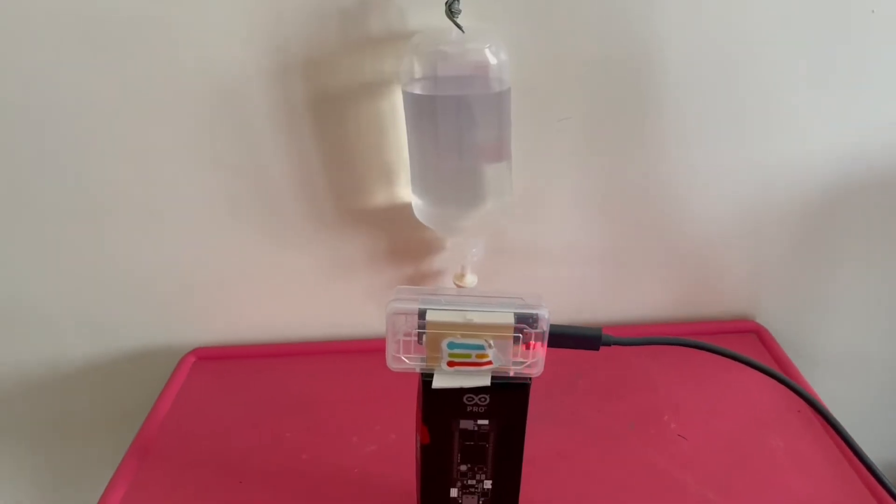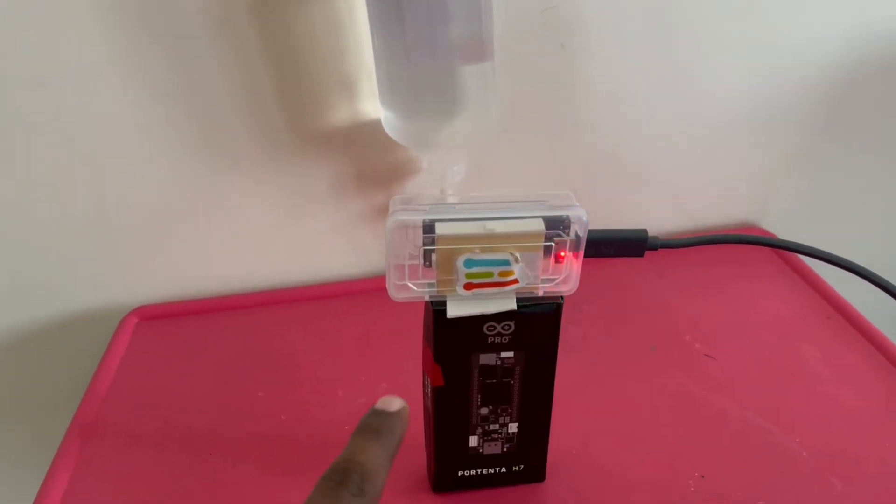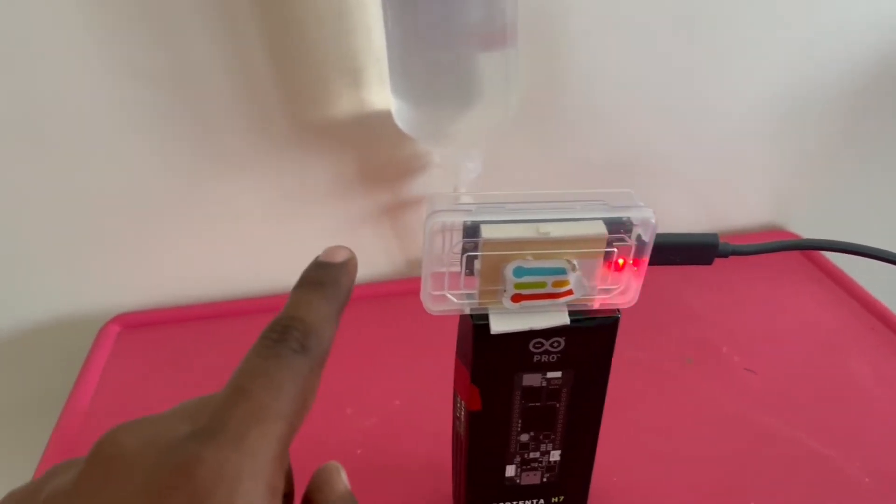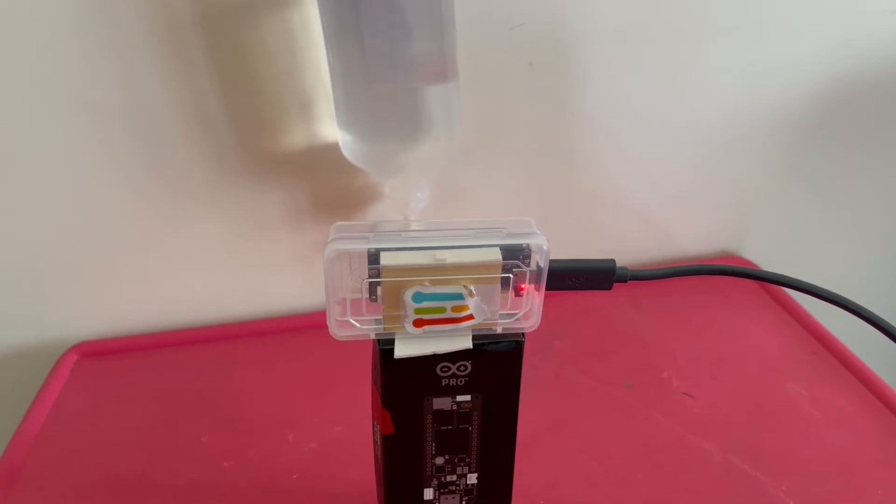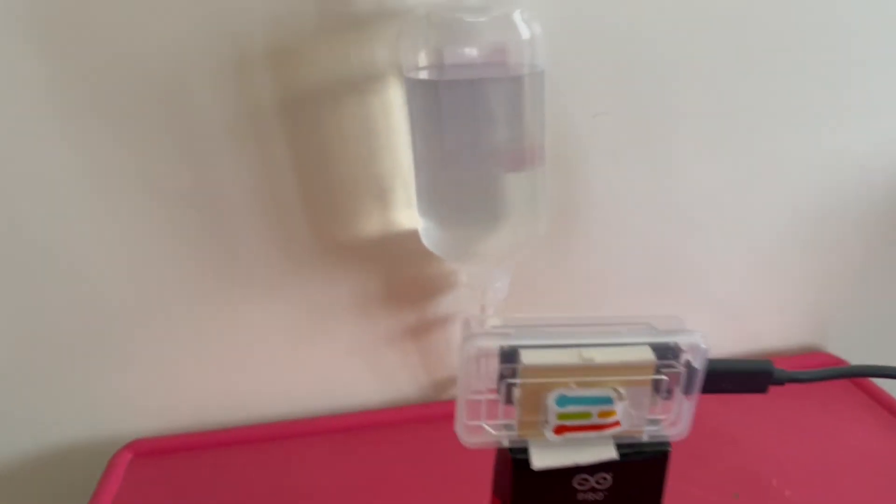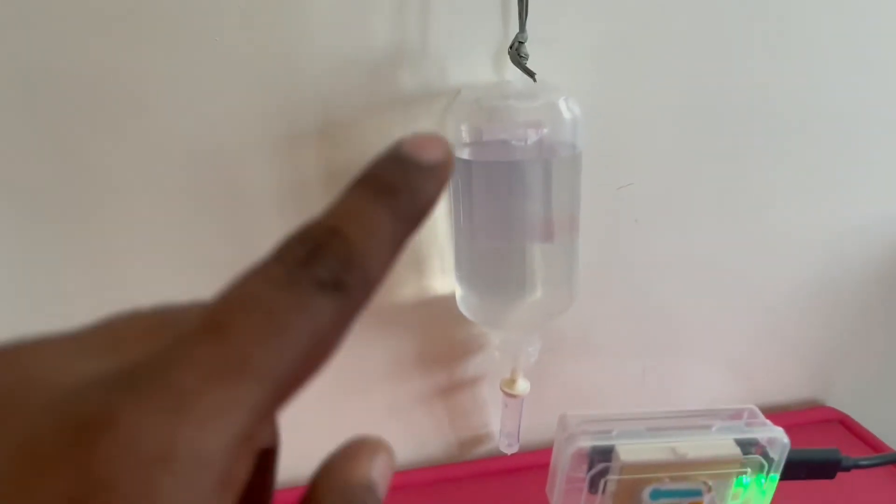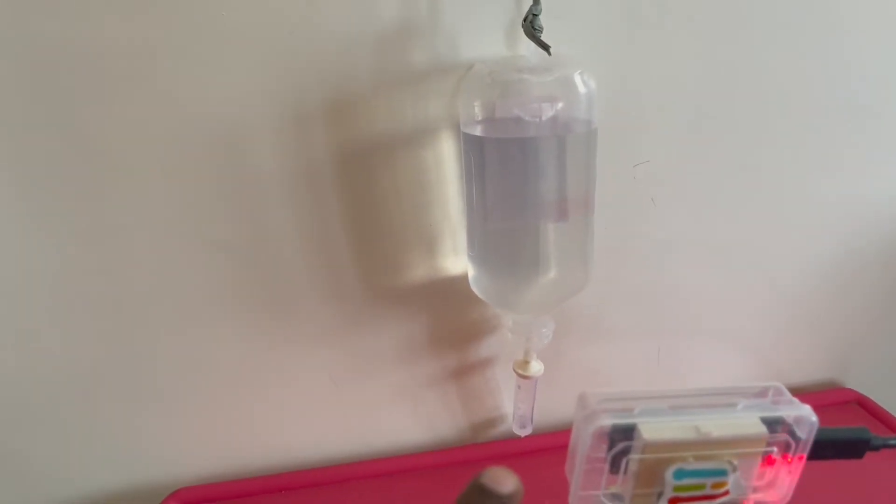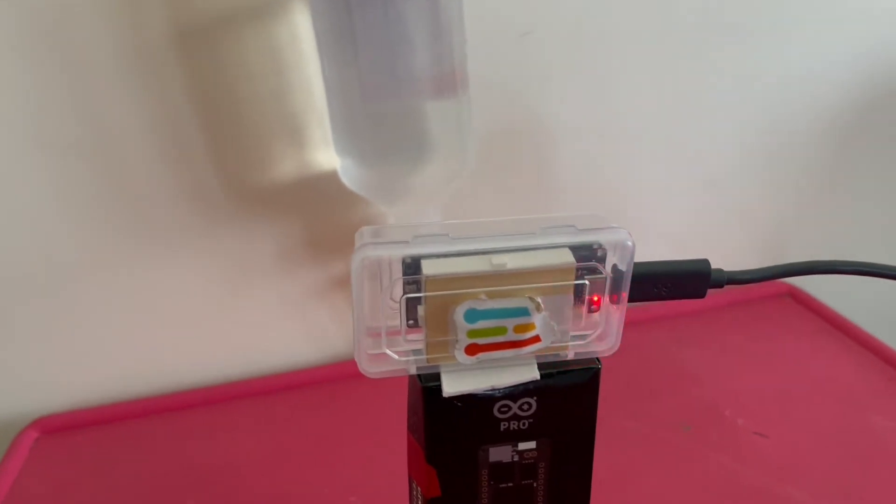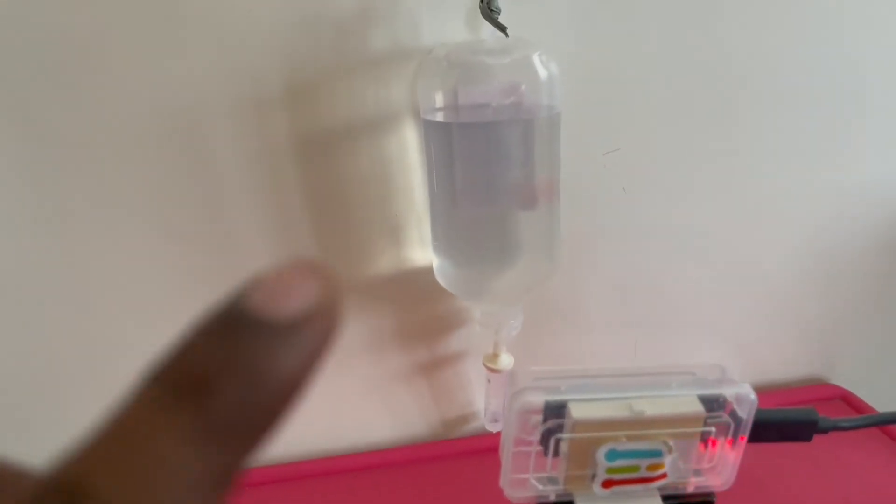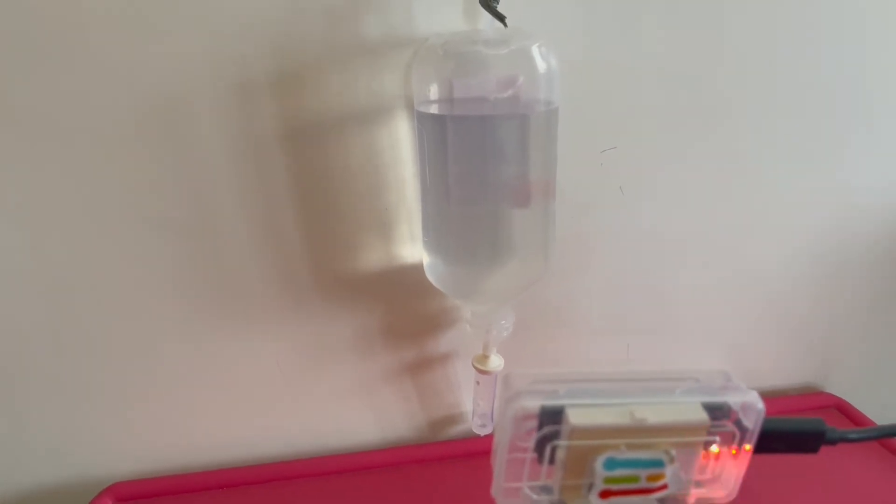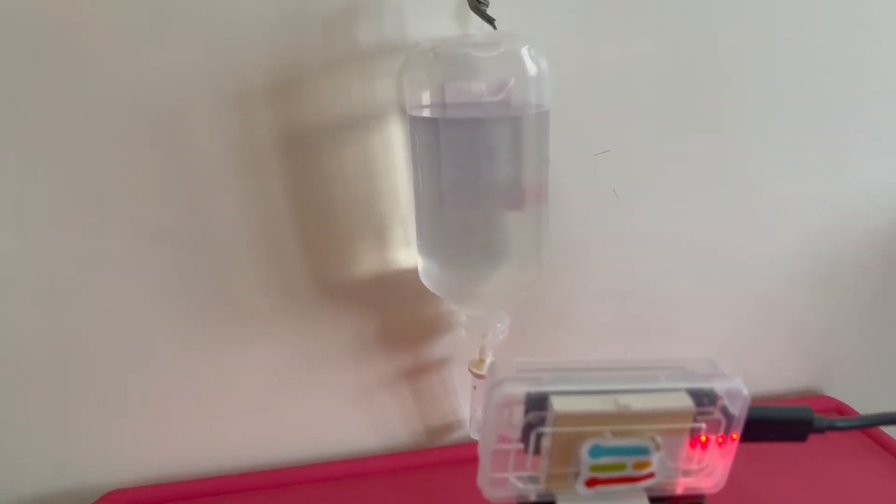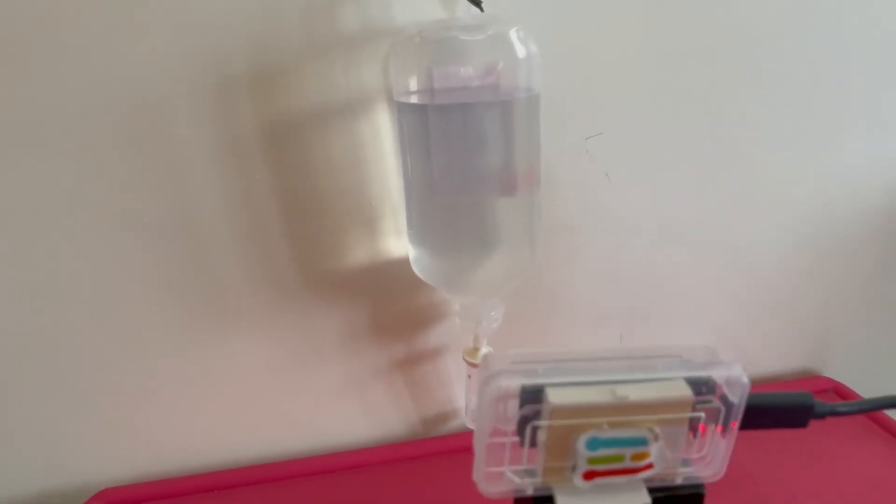Here is the prototype setup. I used Arduino Portenta H7 with a vision shield. For data acquisition and model training, I used Edge Impulse software. In this setup you can see an IV drip where it's in open condition. I'm doing the data acquisition, collecting data for three different datasets: adequate, less than 50 percent, and low level. I hope you've seen the hardware setup and complete data acquisition stage.